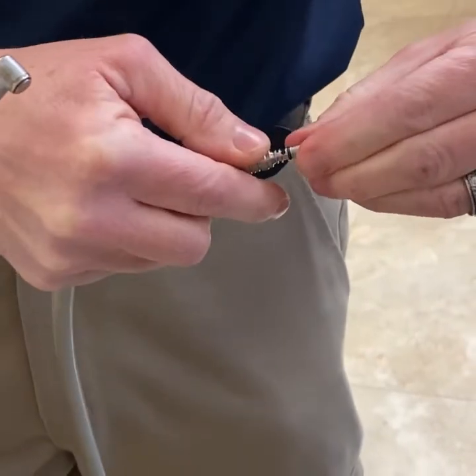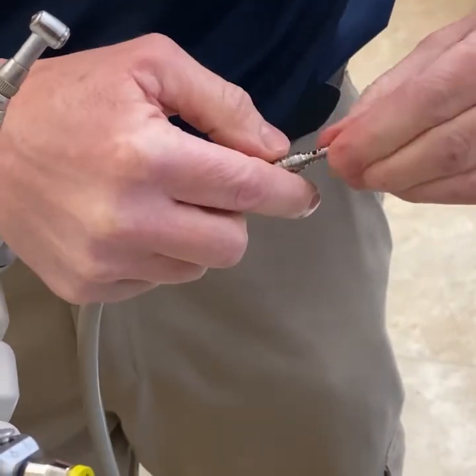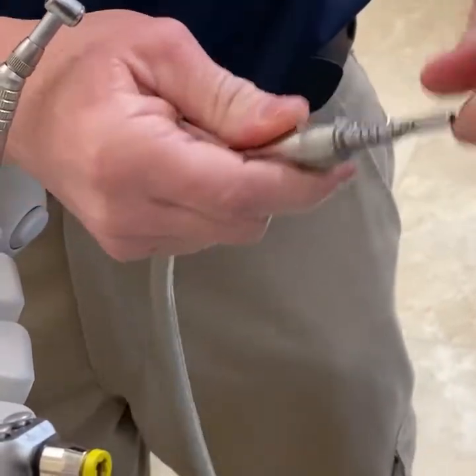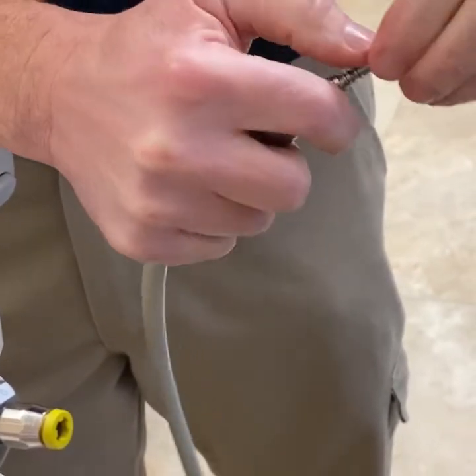First remove all the old o-rings. Once I've got the old ones off, I just reverse the process and put the new ones on. I start with the small ones usually and just work my way down the line.